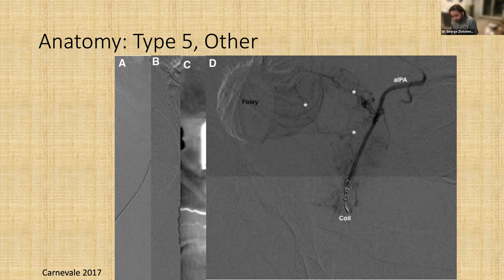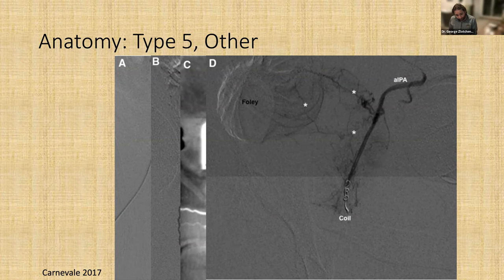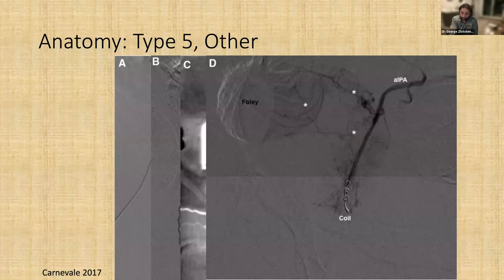If I'm worried that the prostate artery has a common origin with the accessory pudendal or has any flow to the penis, before I decide to embolize, I will ask the patient how concerned they are about erectile dysfunction, because I don't want to make their erectile dysfunction worse. The pathophysiology of erectile dysfunction is from an arterial issue. So theoretically, you can make it worse by cutting off more blood supply to the penile artery, although there's a lot of collateralization.